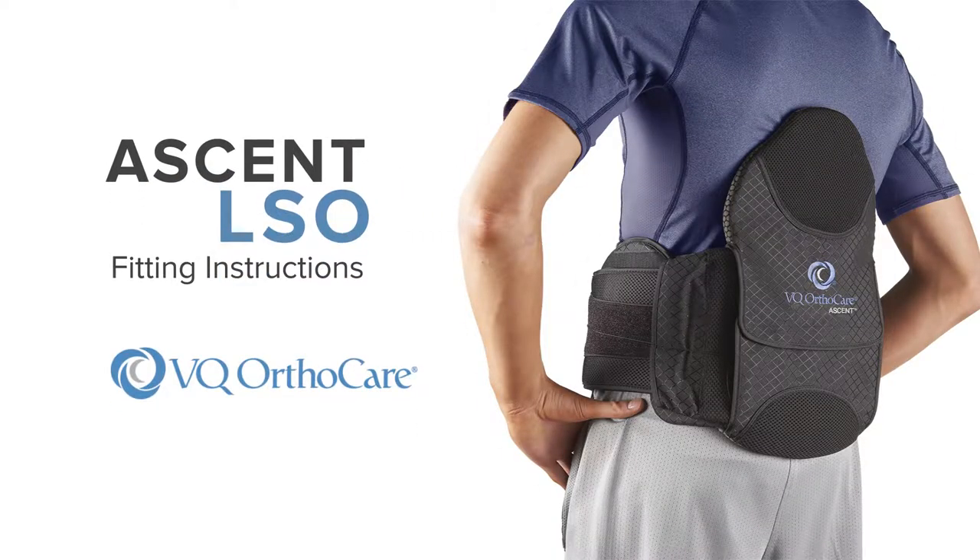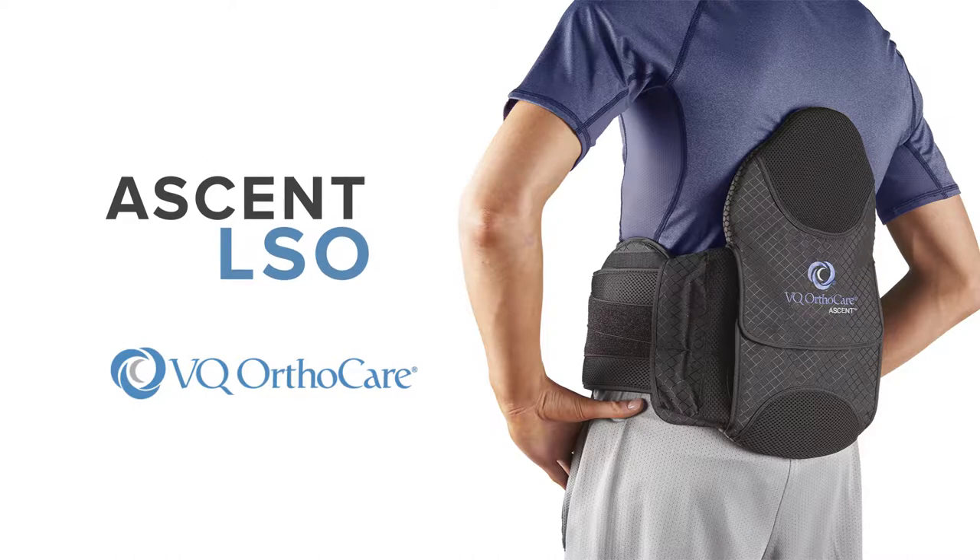Ascent Spinal Orthoses Fitting Instructions. Adjusting and sizing the brace.